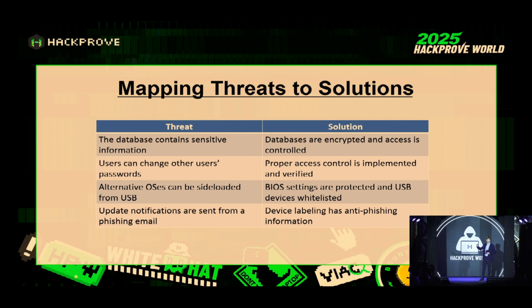And it's hard to say what the next problem is going to be in years. So trying to stay on top of it, trying to continually threat model a device and not just have it be a one and done process is important.